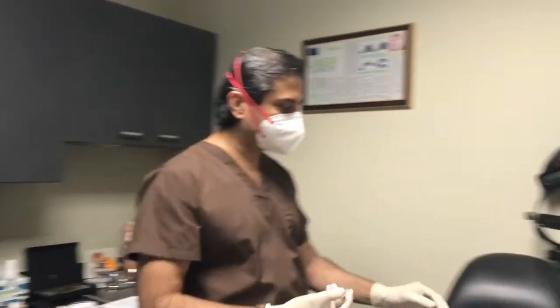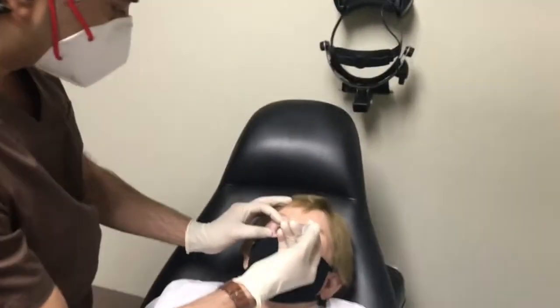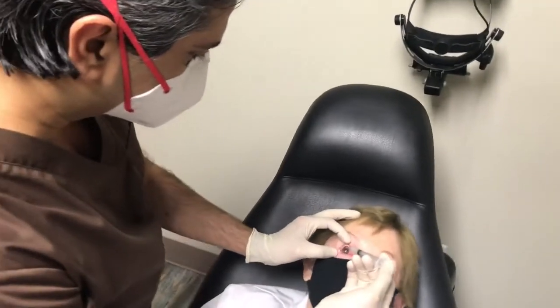Using a blunt cannula, I'm taking it and basically putting some drops of the amniotic fluid on her cornea, right there. Linda, you comfortable? Mm-hmm.